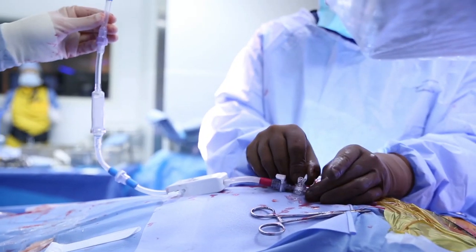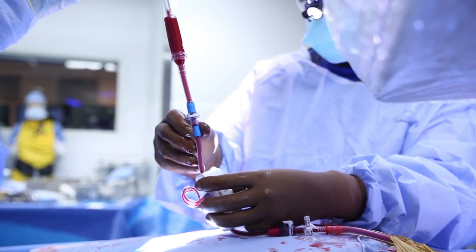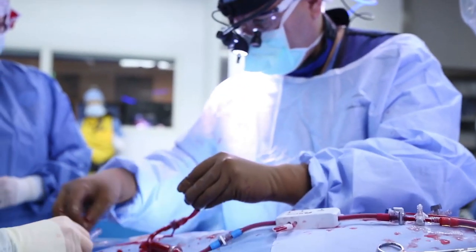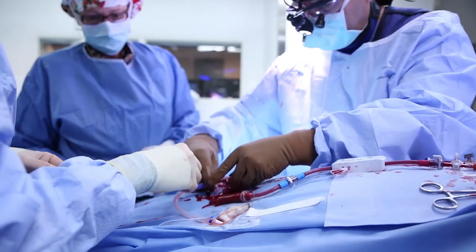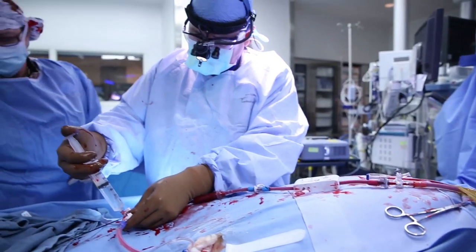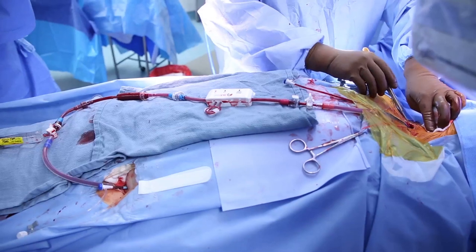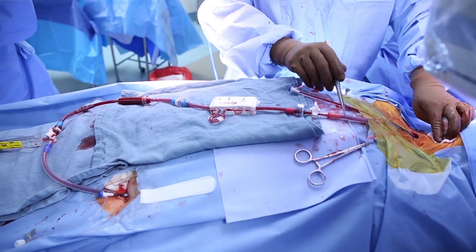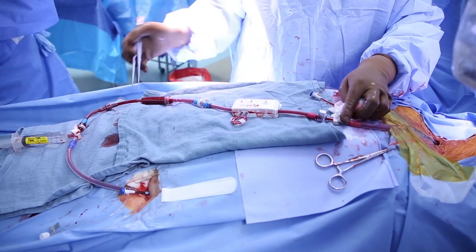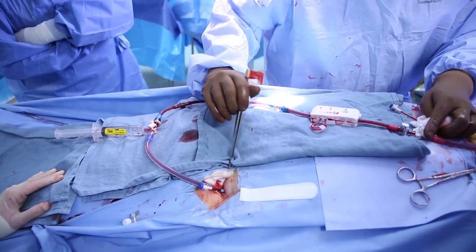The sheath was secured to the chest with an Ioban dressing and the flow reversal tubing connected to the arterial cannula with appropriate back bleeding. The tubing was then connected to the venous return sheath and confirmation of good flow in both low and high flow settings was performed with injection of heparinized saline solution. The flow reversal system was connected to the arterial cannula, allowing flow reversal due to the differential pressure between the common carotid artery and the femoral venous pressure.